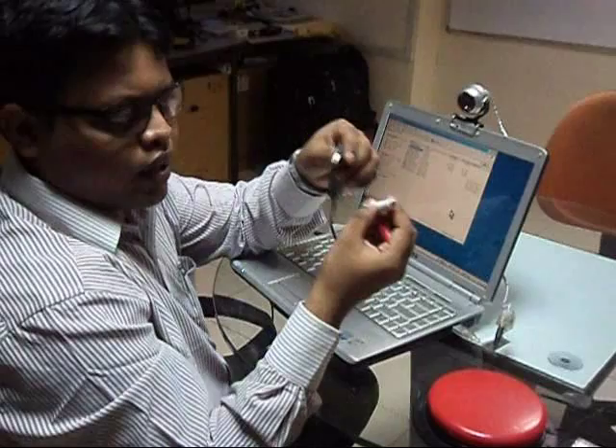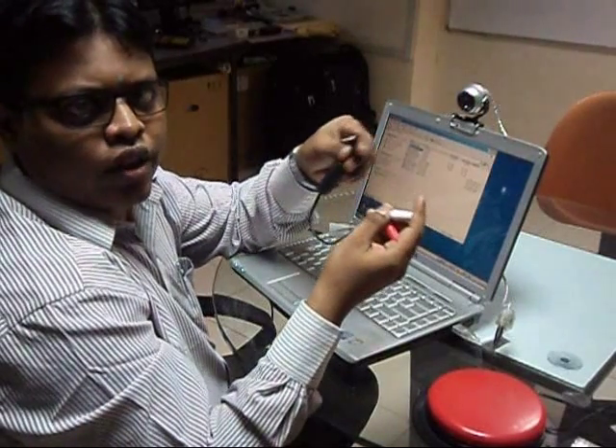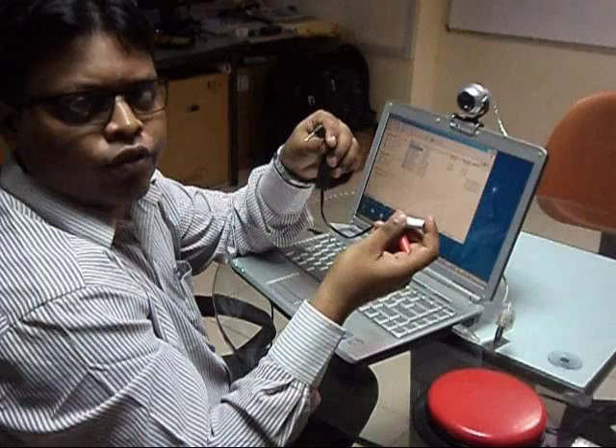With this additional connector, you can connect two switches to your Tracker Pro such that you can use one for left click and the other one for right click.